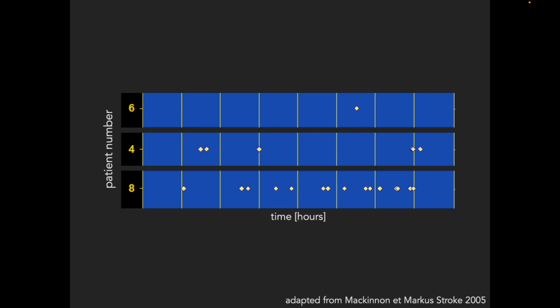A lot of data that have been published on microembolic signals rely on a 1-hour recording. But you can easily see, for example, in patient number 4 that we have negative and positive hours. These 3 patients are, by the way, all patients with a symptomatic carotid artery stenosis. And the measurement took place in the ipsilateral middle cerebral artery.